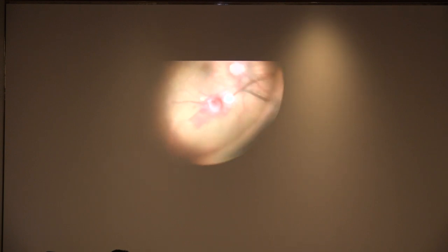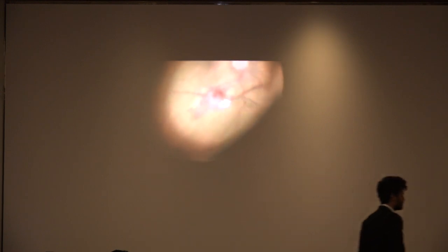I was hoping it would be a macroaneurysm, and considering her age, I just hoped and prayed that it was not a melanoma. And so I thought, okay, if it's a macroaneurysm, it's going to be useful to do a little bit of laser. And we did a surrounding barrage also, to ensure that if it was something malignant, we were not disturbing the periphery, and a burnt area in the periphery of the lesion would probably help in stopping the lateral spread of any cells.